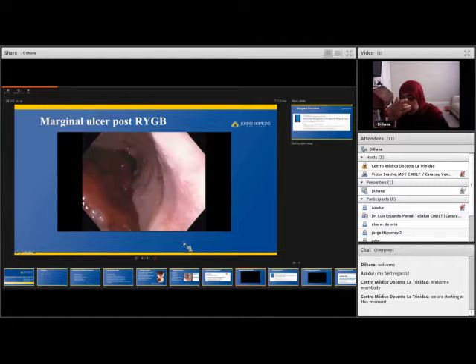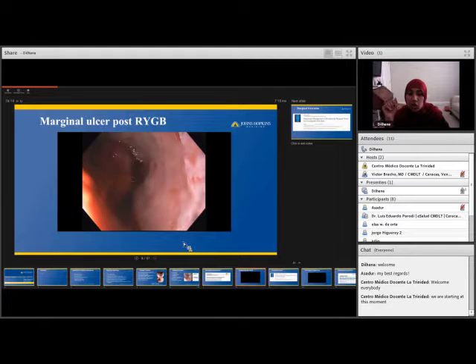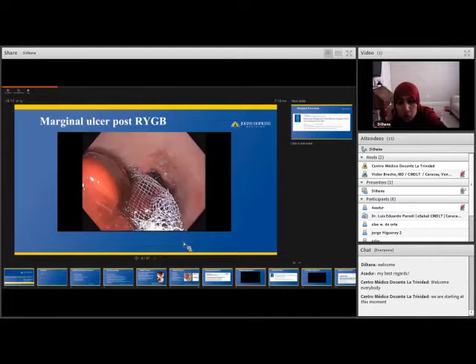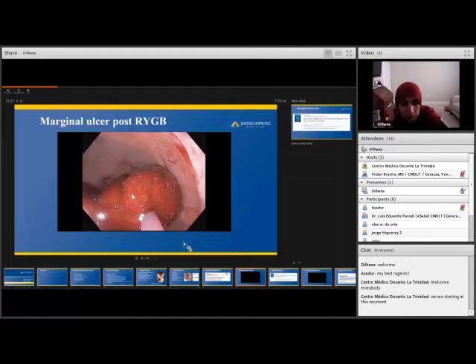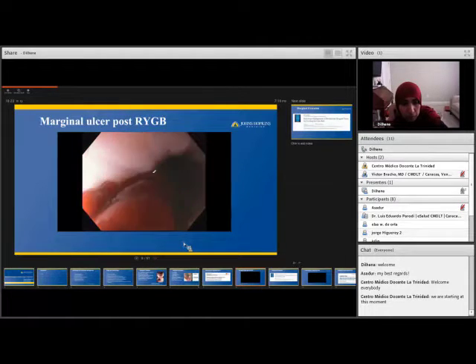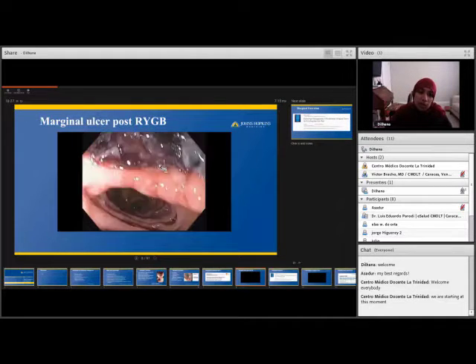Now, we can use endoscopic suturing for massively bleeding marginal ulcers, and this can be used even up to 10 days post Roux-en-Y gastric bypass. And this is a video I'm going to show you from our institute, and this was written up as a video submission. So I'm just going to play this for you.